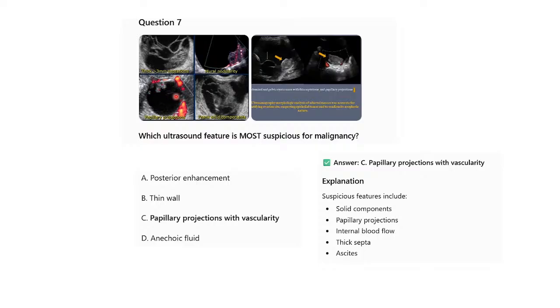Myself, I was thinking that there is hemorrhage, but I was thinking that hemorrhage, blood clots don't have blood flow inside. Otherwise, you can also see a shunt, an arterial venous shunt that is happening there between the carotid and the jugular vein. So the explanation, but on color, you can see that these two are distinct.